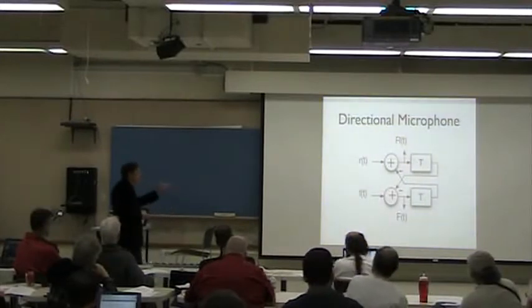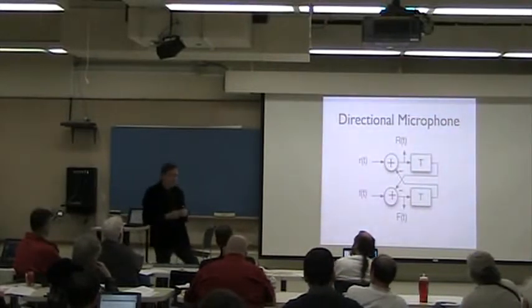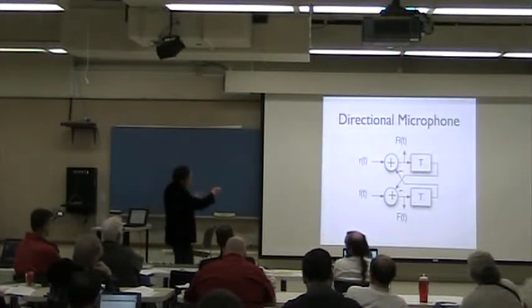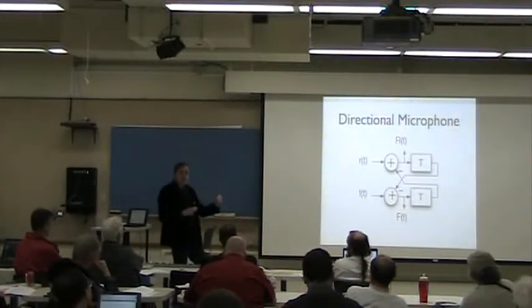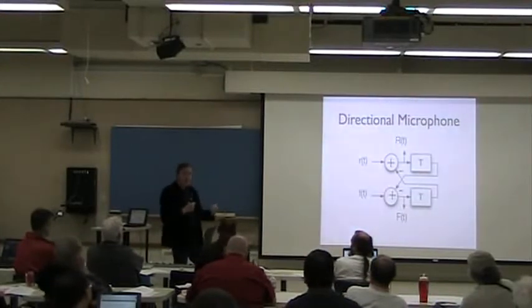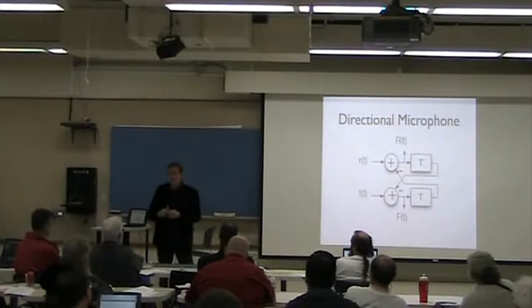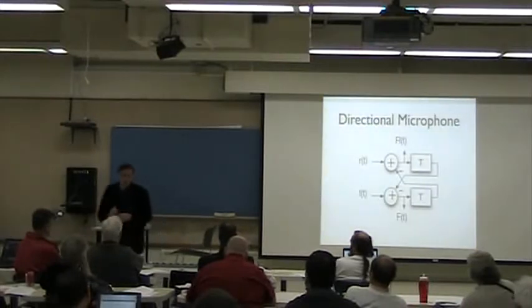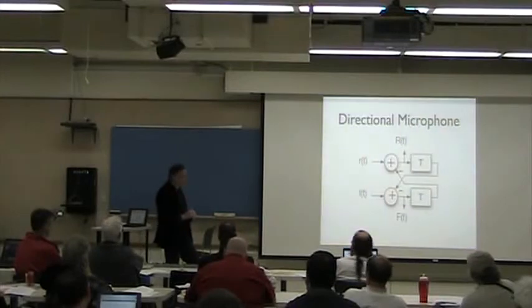The way we do this delay is using linear Lagrange interpolation. So how does it work? You have two signals from the two microphones, the rear microphone and the front microphone. The distance between these two microphones is, in our case, 7 millimeters, and 7 millimeters is about a 20.5 microseconds delay.